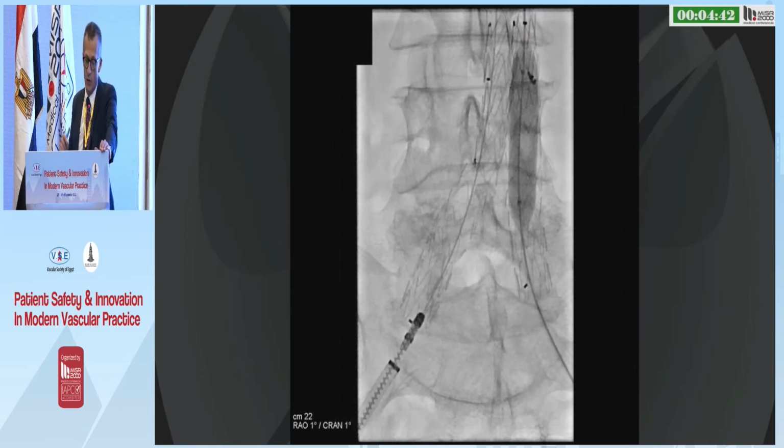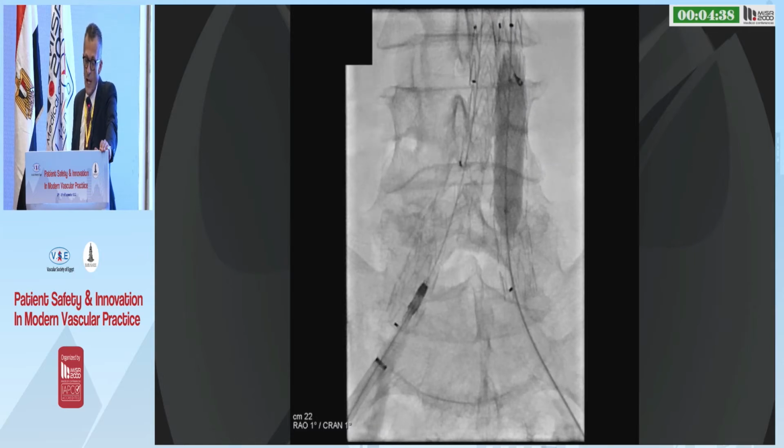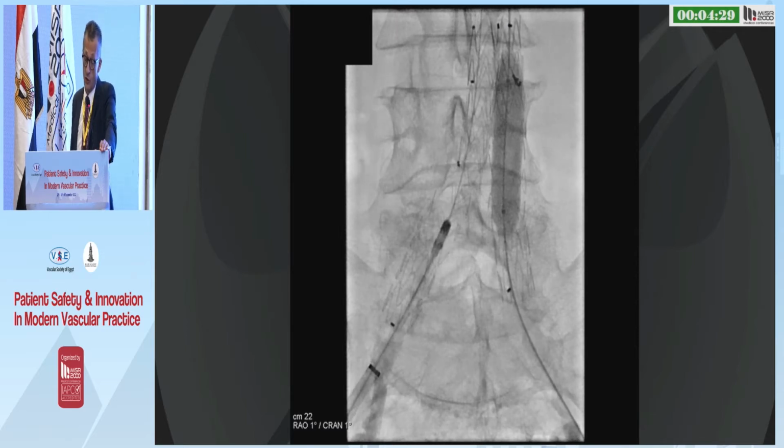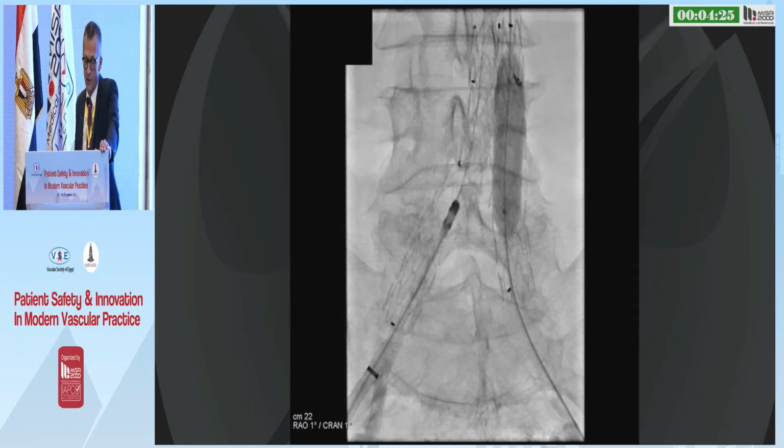Again, we inflate a balloon in the contralateral side, a rescue maneuver. And we place a 12 French sheath to maintain a continuous infusion of heparinized solution and to work with effective lubrication.